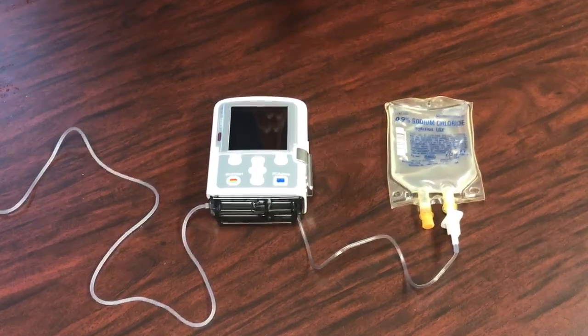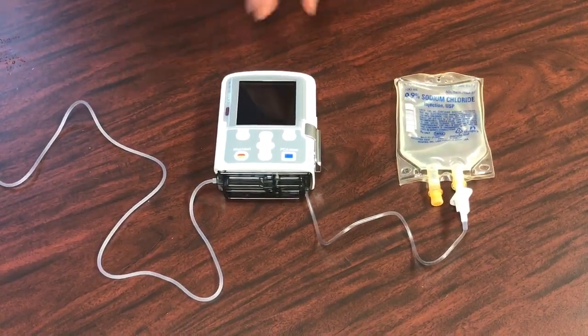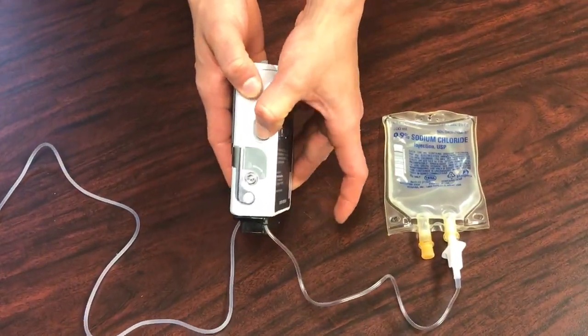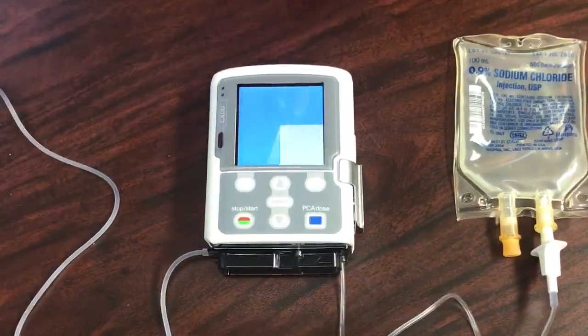After you have attached the cassette tubing to the pump, go ahead and power your pump on. The power button can be found on the side of the pump — just press that so the pump can be powered on.